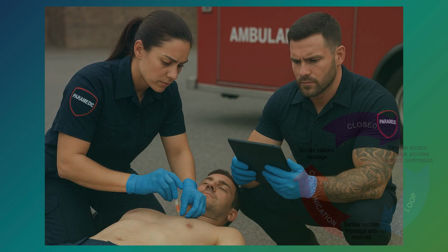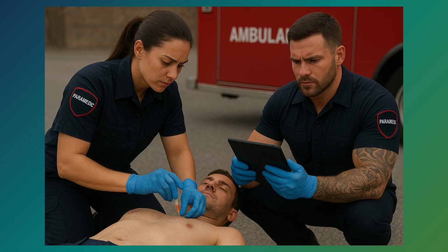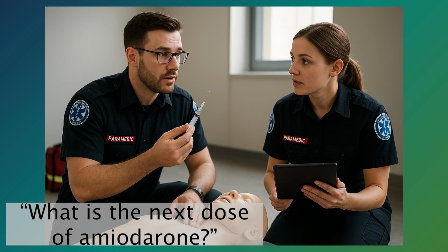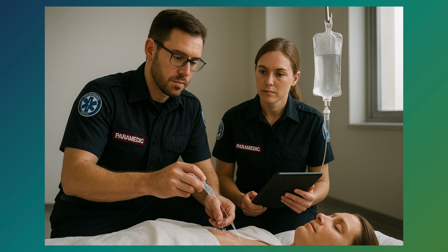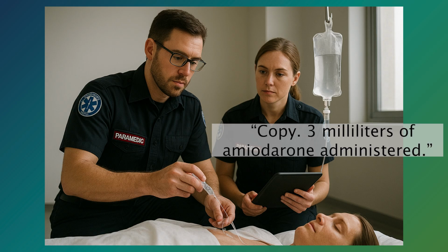For example, "1 milligram of epinephrine administered IO." "Copy. 1 milligram epinephrine administered IO." Another example is, "What is the next dose of amiodarone?" "The next dose of amiodarone is 3 milliliters." "Copy, preparing 3 milliliters of amiodarone." "3 milliliters of amiodarone administered." "Copy, 3 milliliters of amiodarone administered."